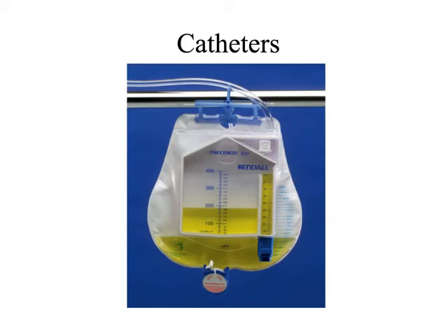Yeah, there's contamination. I'm risking contamination because of something else. I want to make sure that if I clamp off a catheter, I remember to unclamp the catheter, right? The problem is if you're in any way forgetful like I am, I'm constantly looking for ways to remind myself in the hecticness of the workforce, like, oh my God, I forgot to take the hemostat off that thing. Let me run after them and grab it before they get up to the floor, and the nurse yells at me. So there's been times where I've forgotten to unclamp it, right? So I learned to use the hemostats.